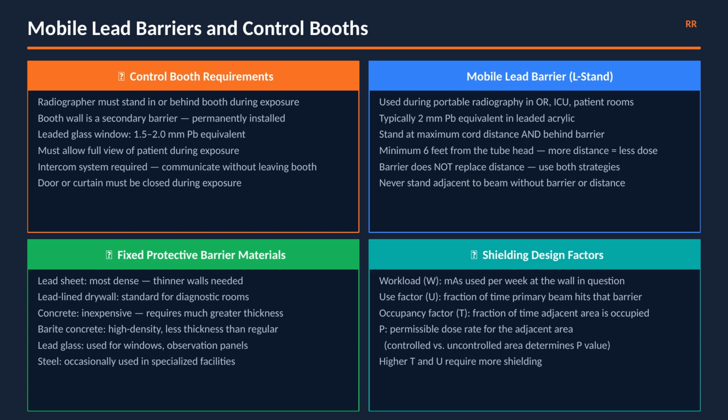An intercom is required. You must be able to communicate without leaving the booth. The door or curtain must be closed during every exposure.